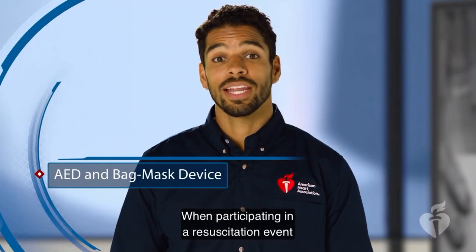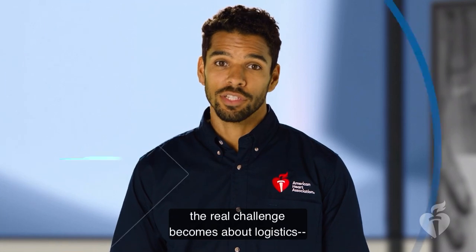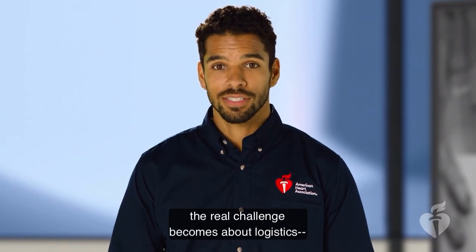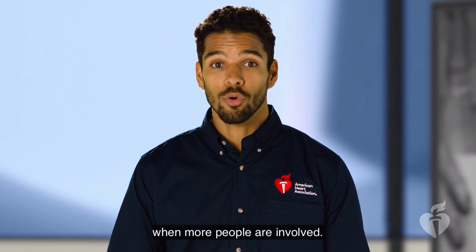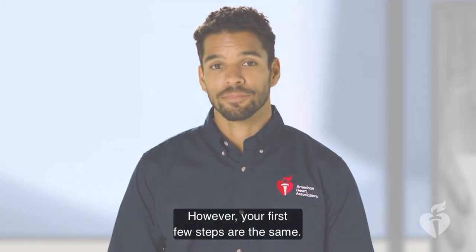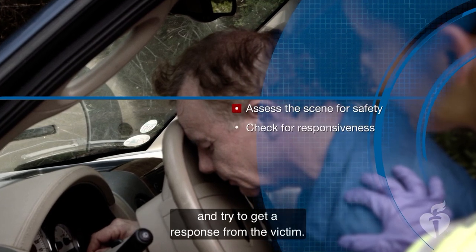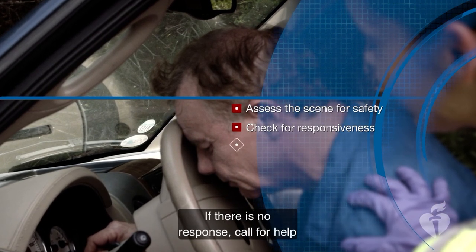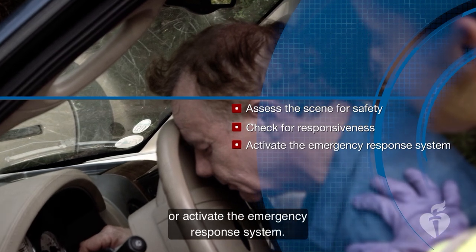When participating in a resuscitation event with rescuers from multiple agencies, the real challenge becomes about logistics. In other words, the coordination of rescuers and resources when more people are involved. However, your first few steps are the same. When you arrive, quickly assess the scene and try to get a response from the victim. If there is no response, call for help or activate the emergency response system.